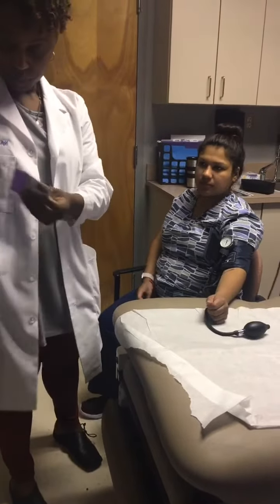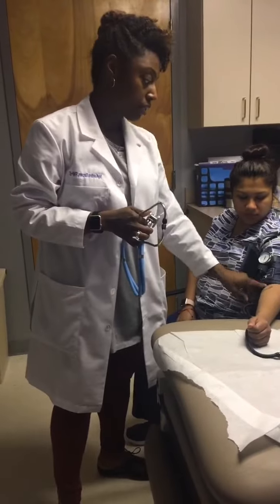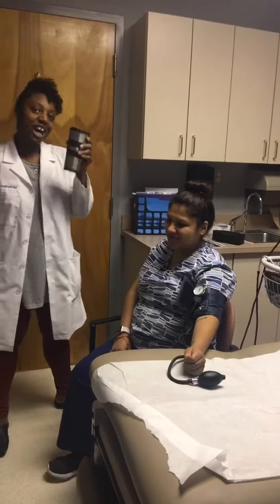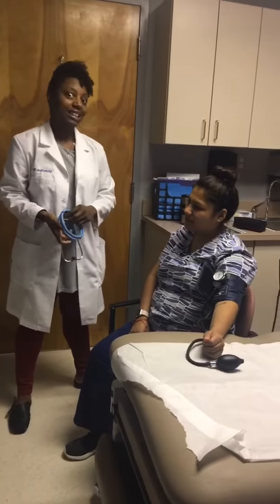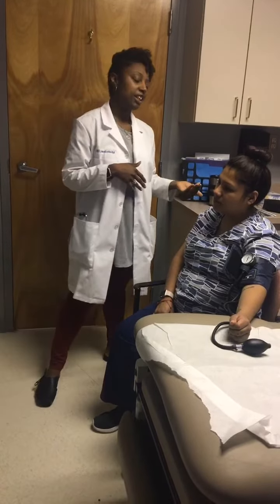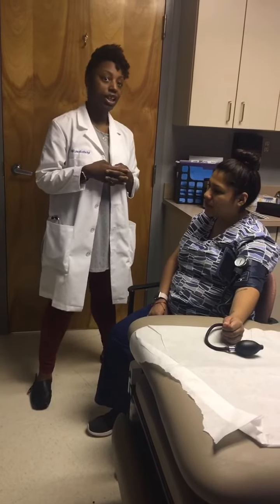With this, you're going to use a good old-fashioned stethoscope. I'm not going to do this because her blood pressure is controlled, but you use the stethoscope to check blood pressure here, and somebody manually should be trained to do that. Her arm is at the level of her heart, so that's a good place for arm placement. Also, we have taken away her coffee — you should not have coffee, you should not exercise, and you should not smoke before a reading. A lot of my patients go out for a smoke break while they're waiting, and that's not good for their blood pressure. You need about 30 minutes for that. If you take medications, you want to make sure you take them before your appointments, because your provider wants to make sure your medicines are working. Janet is not on any medicines, but she started an exercise routine — diet and lifestyle is helpful for blood pressure, and if you're in the in-between phase, you have a good chance of getting your blood pressure under control with lifestyle modifications.